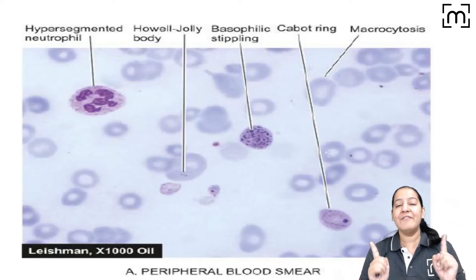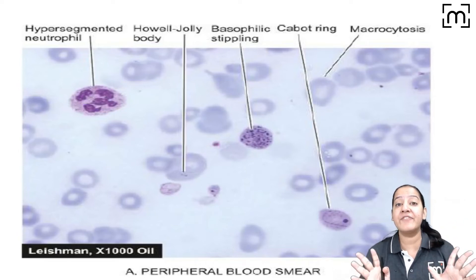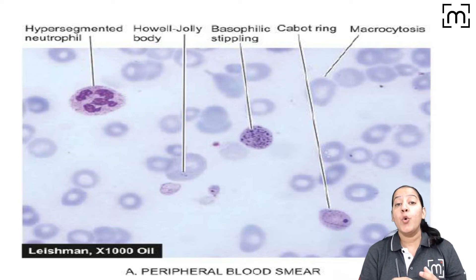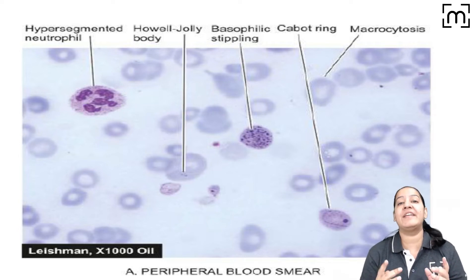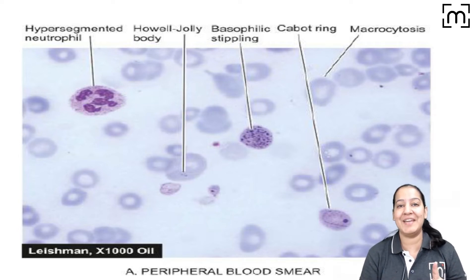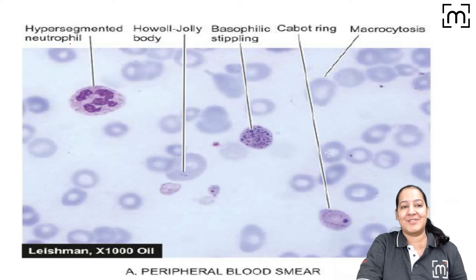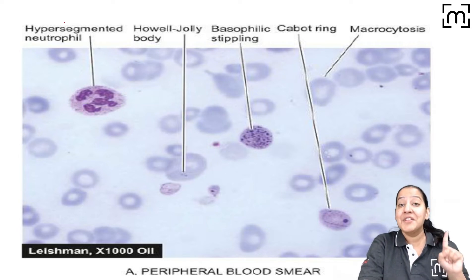Hi friends, here we can see the peripheral smear of a megaloblastic anemia. We can identify that it is megaloblastic anemia based on 5 features. Let me describe the features.